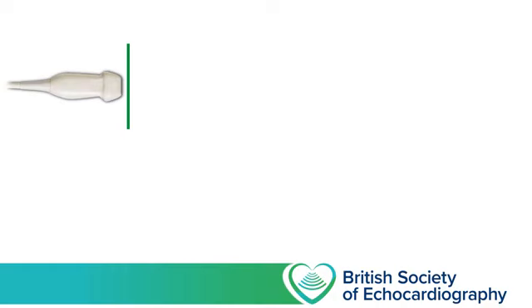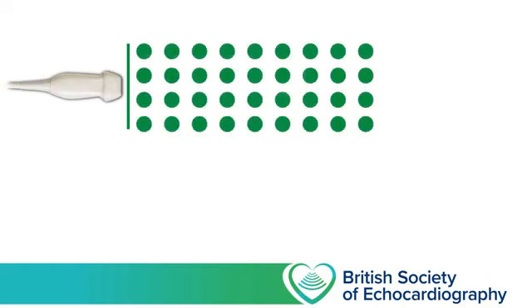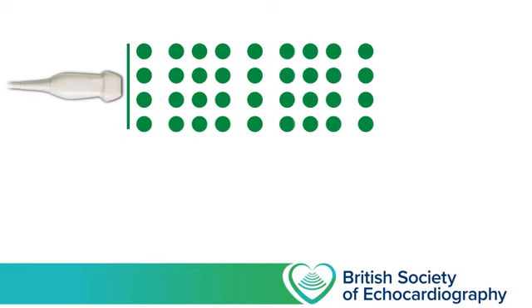So let's hold our probe against the patient's skin, and initially all of the particles in the patient, we can imagine those as being evenly spread apart. Now as we start to generate a wave of kinetic energy, we're going to push those particles. We're going to push some closer together, and because we can neither create nor destroy any particles, if we're going to push some closer together, then inevitably we're going to end up with areas where some of the particles are spread further apart than they were at rest.